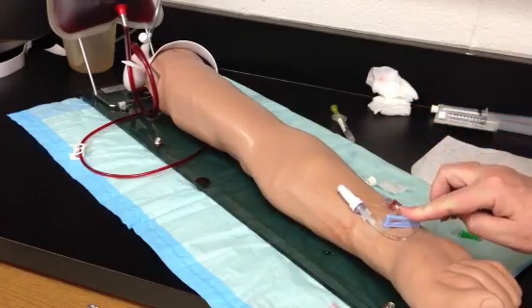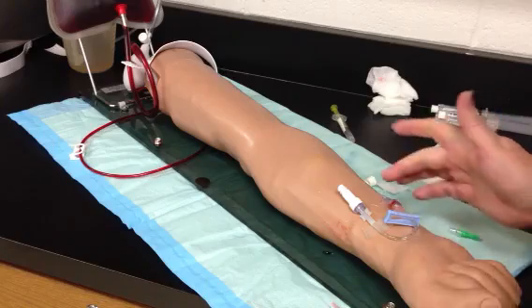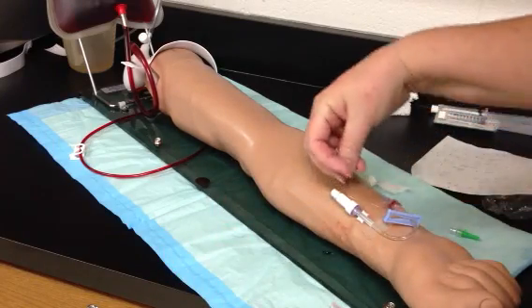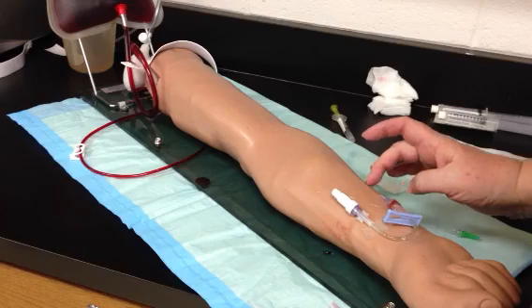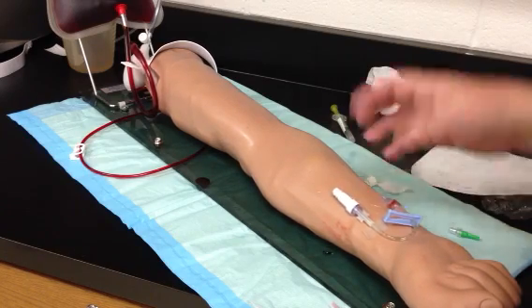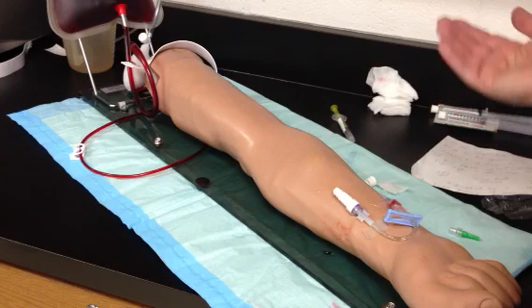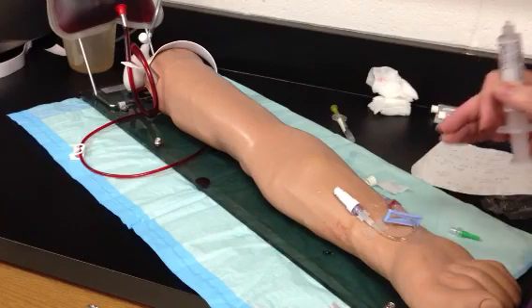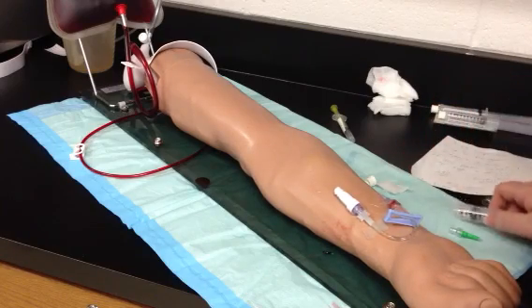Always make sure that you lock and then disconnect, because if you pull this out, it allows a little bit of suction, which will pull back a small amount of blood into the end of your vena cath, which then of course would clot and cause you difficulty to access it the next time. Now, that is pushing through a saline lock.